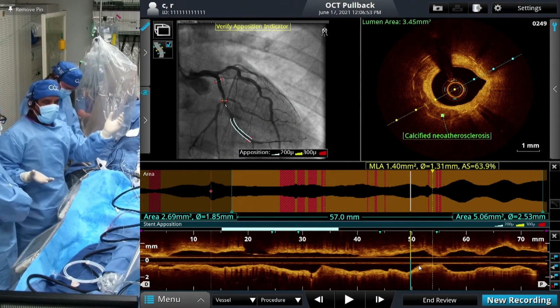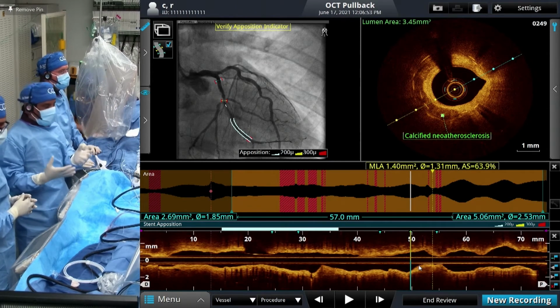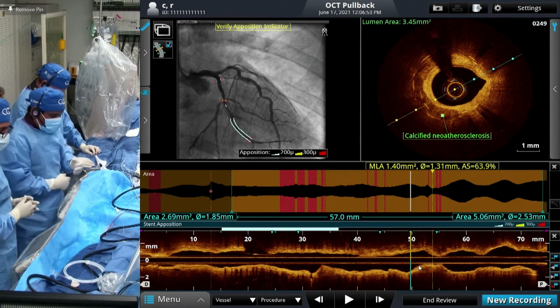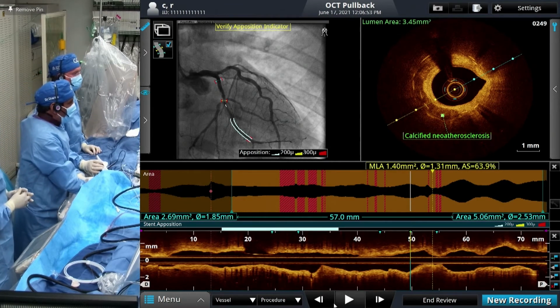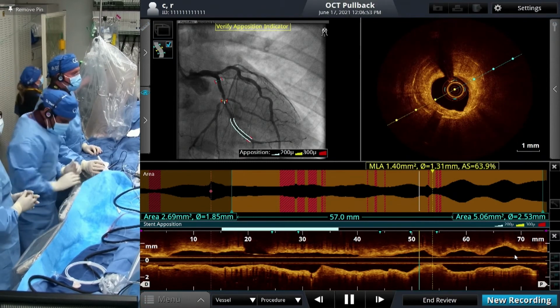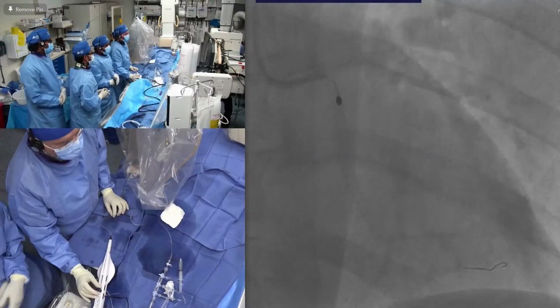As you know, with multi-layer, our goal will be to do IVBT. These are the cases where we don't have drug-coated balloon, and we'll hear a quote from Colombo. Looks like Antonio loves the drug-coated balloon now. And maybe once it comes, quite a bit, but here we have only IVBT.